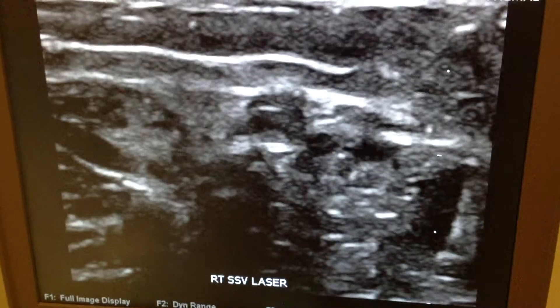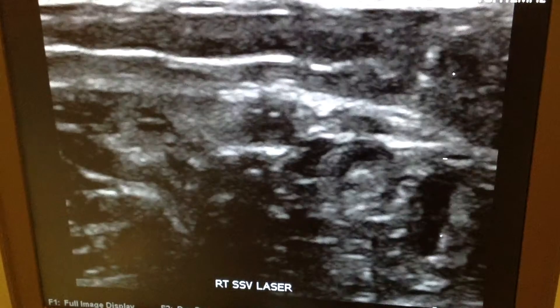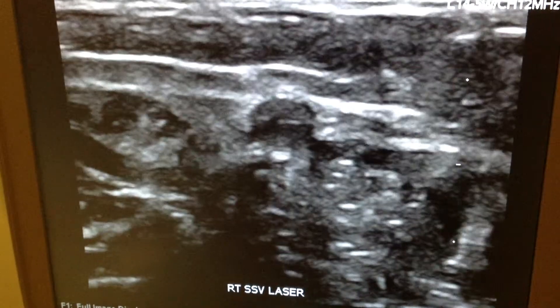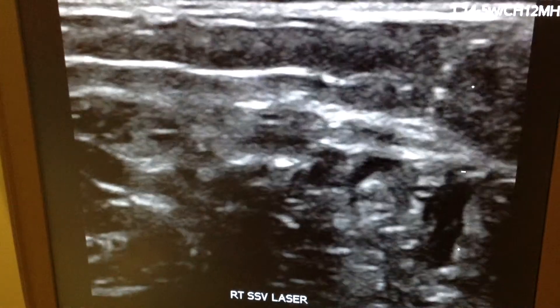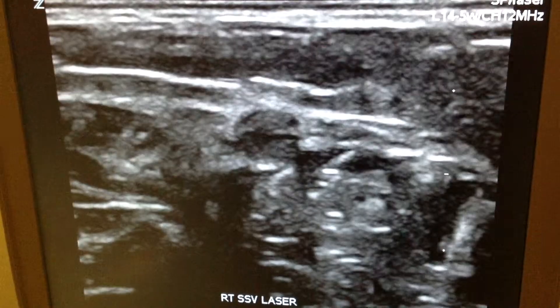This is a cross-sectional view of the valve. You can see the lips of the valve and the leaflets of the valve. This is a short-axis view.